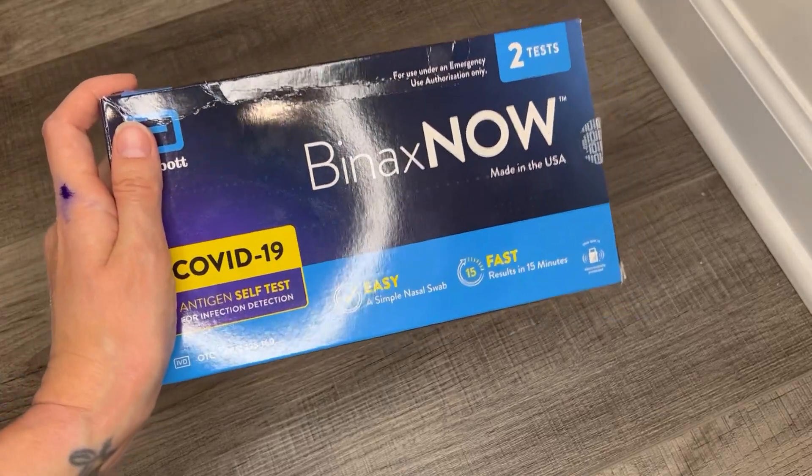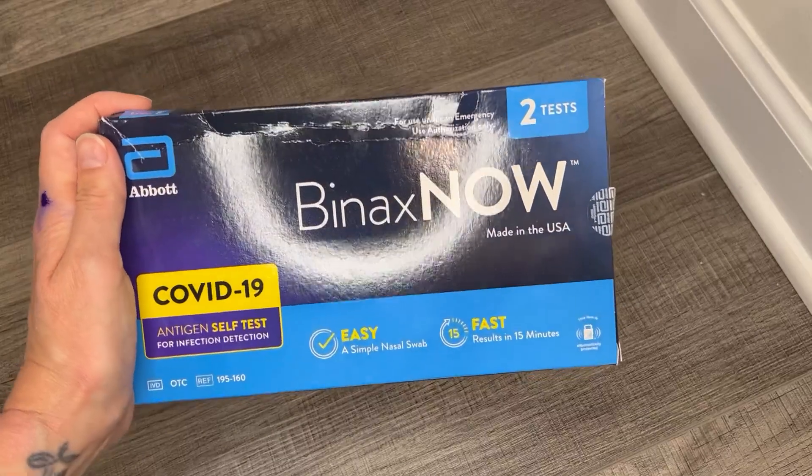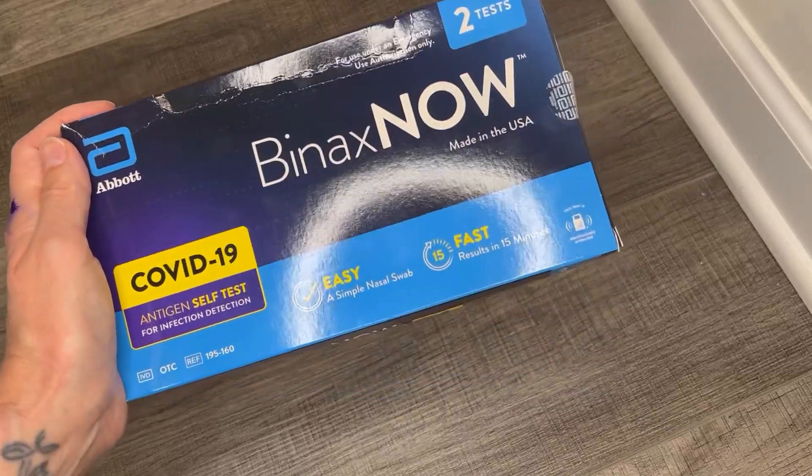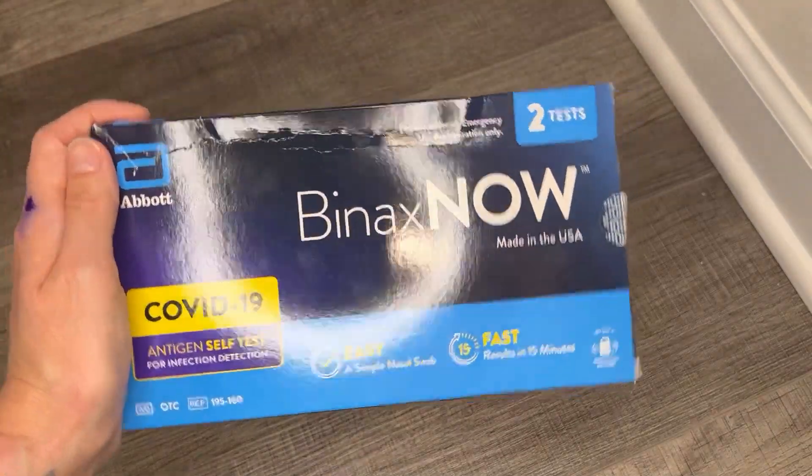Hey guys, it's Allison. Just wanted to go over this Binax Now COVID-19 antigen self-test. So they say that this is an easy, simple nasal swab, results fast in 15 minutes.